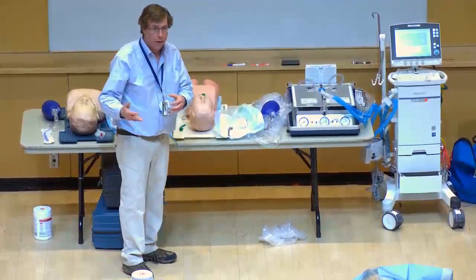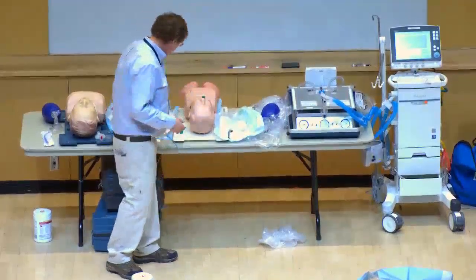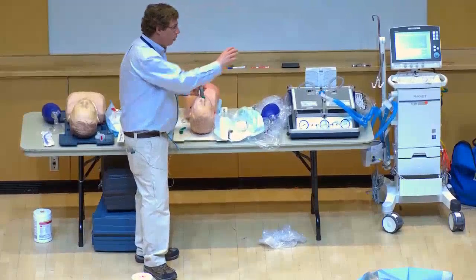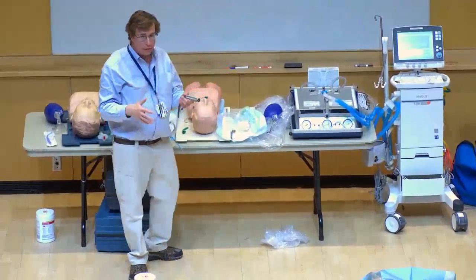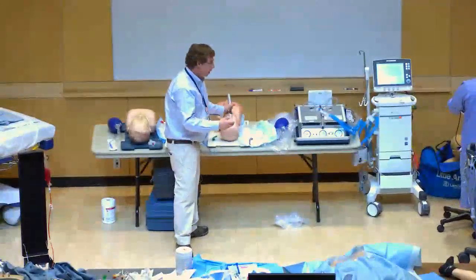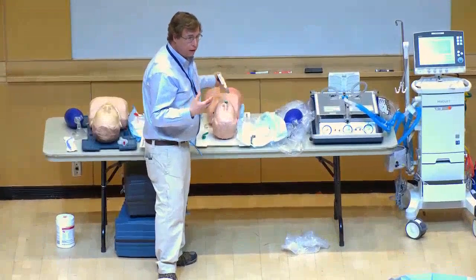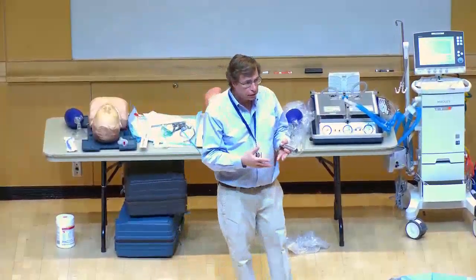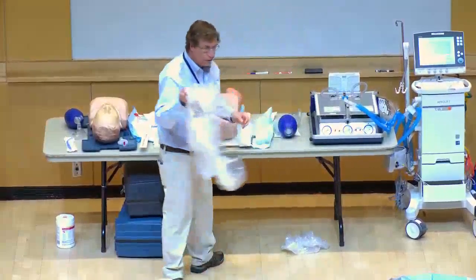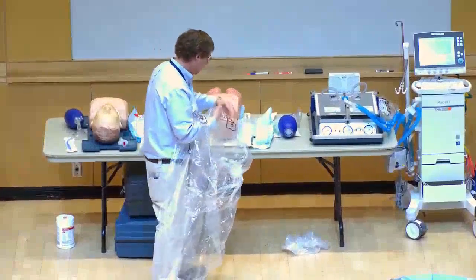Each ventilator comes in a ventilator bag. You can make a small hole in the bag, pop it over the patient, and pass the mask through the hole to create a self-contained circuit during pre-oxygenation. This limits aerosolization of secretions while you pre-oxygenate for two to five minutes before induction. These patients, once anesthetized, desaturate very quickly due to poor functional reserve, so adequate pre-oxygenation is critical. You can still see their face through the bag and perform jaw thrusts.